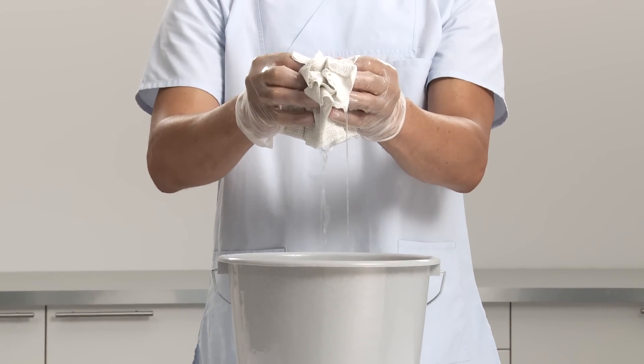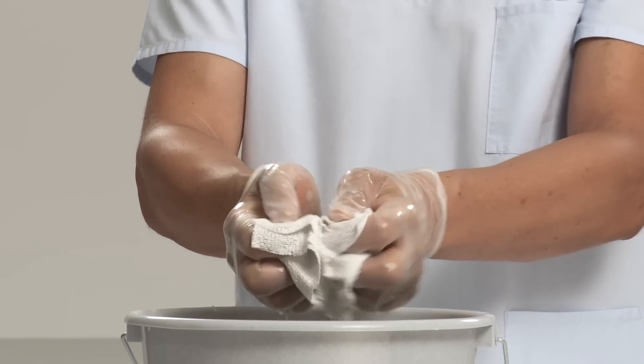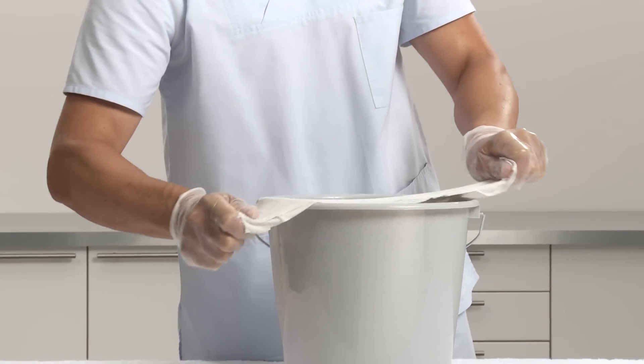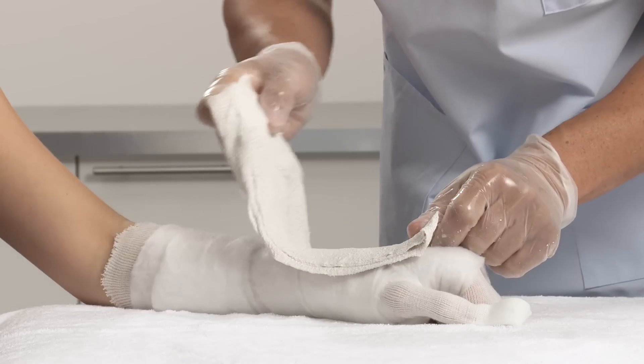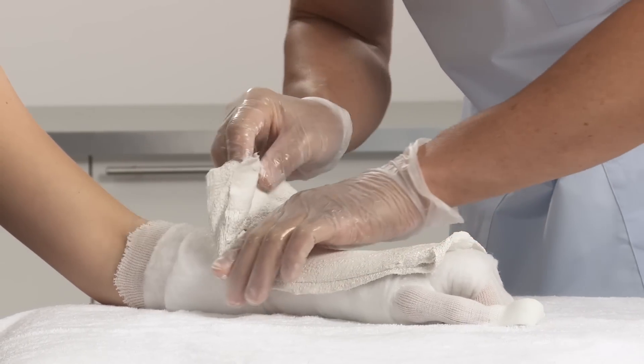Activate the splint by dipping into cool water, holding the ends and maintaining the splint fold. Remove from water and gently squeeze to drain. Straighten out the splint and run it over the edge of the bucket to smooth and dispose of surplus water. Apply the splint onto the patient's arm and gently smooth down.